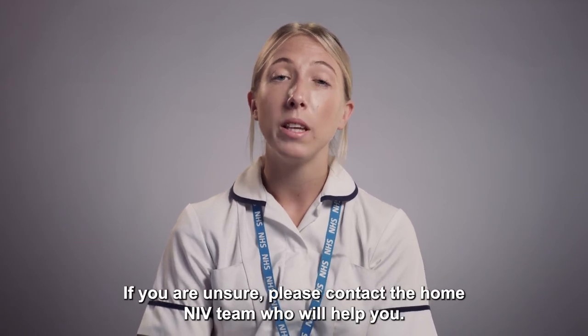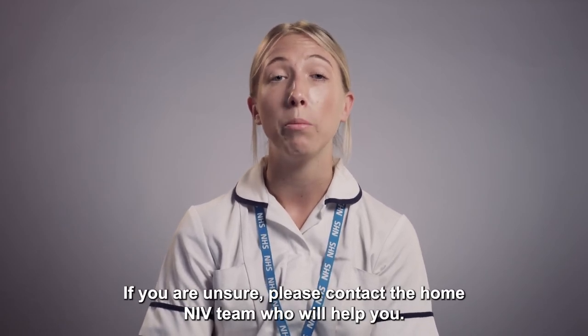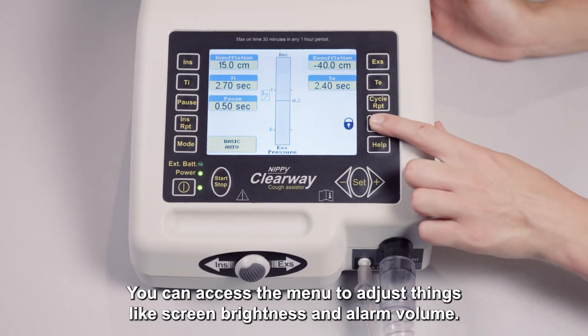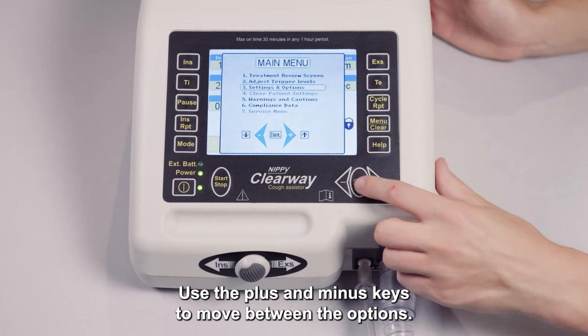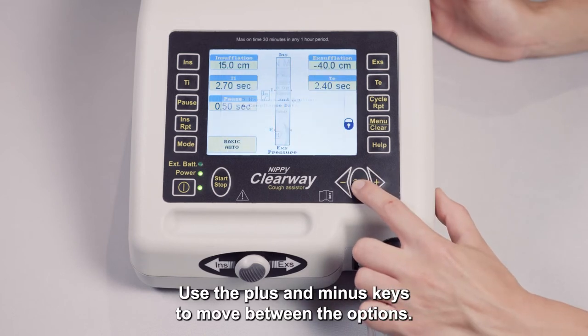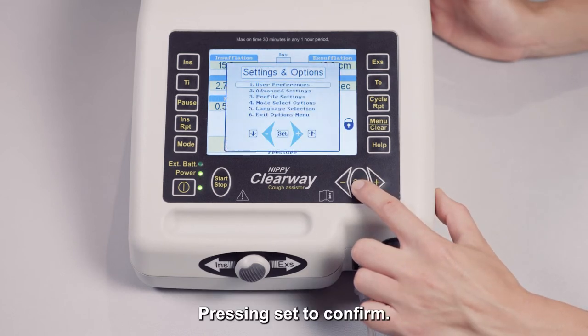If you are unsure, please contact the home NIV team who will help you. You can access the menu to adjust things like screen brightness and alarm volume. Use the plus and minus keys to move between the options, pressing set to confirm.